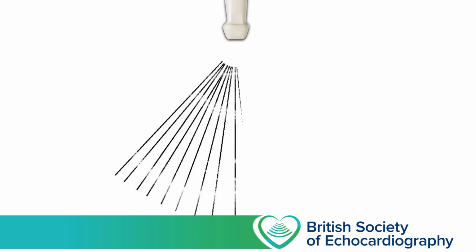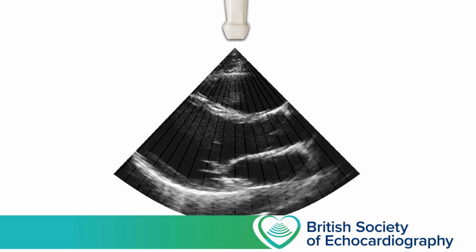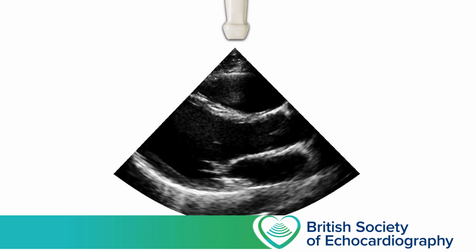So that's going to give us information in one dimension, but now we're going to convert that into a two-dimensional image. So to generate our 2D image, we're going to create multiple one-dimensional lines of information that fan out from our probe. These scan lines, which fan out from a probe, run not quite parallel to each other, such that they're closer together in the near field and spaced further apart in the far field. The ultrasound software then uses an averaging process to fill in the gaps between the lines. So you can see how having a greater number of lines will increase your resolution, as there will be less requirement for the averaging process to fill in the gaps.